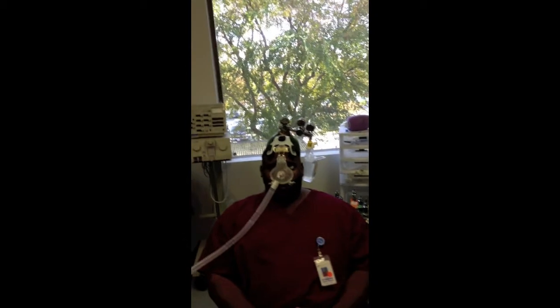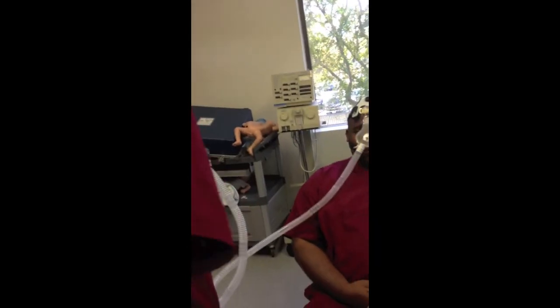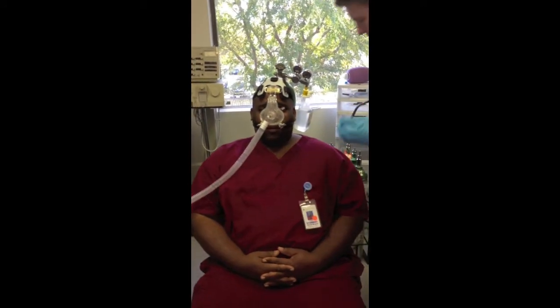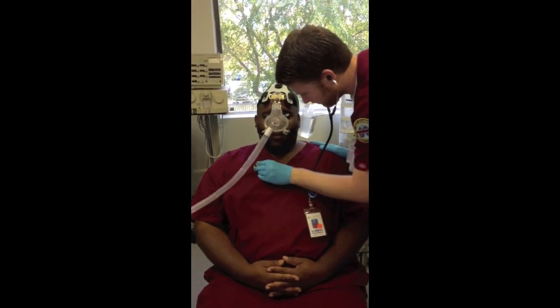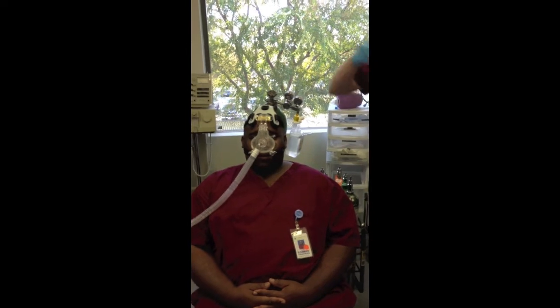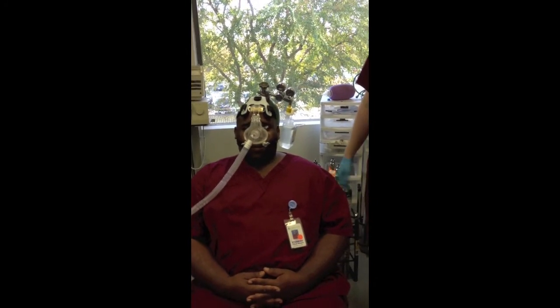Monitor the patient's arterial and pulmonary artery pressures when available. Also auscultate the chest to assess any changes or adverse reactions. Monitor patient for any adverse effects.